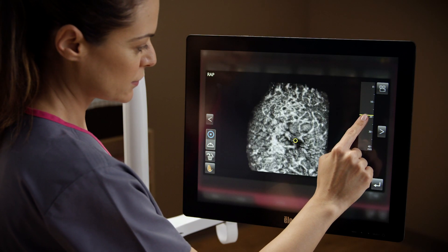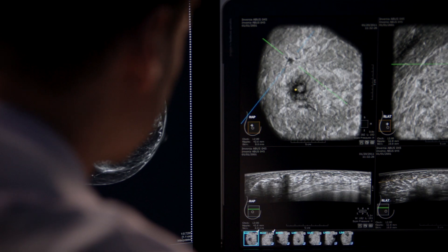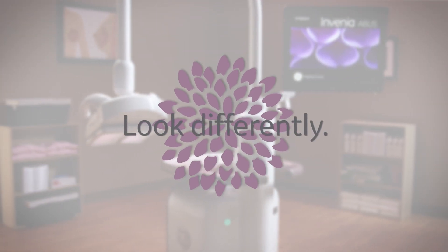After your exam, the operator will send your images to a radiologist to be evaluated, and you will be contacted with your results. Invenia ABUS 2.0 — helping physicians look differently at dense breast tissue.